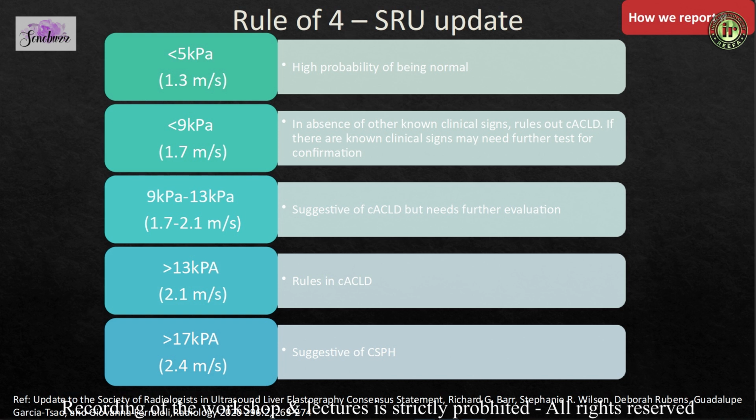Now this can be applied for almost anything, even in children, because there are no known cutoffs published for children. So even in these cases, when the kid comes to you the first time, you have those values as a baseline value, and you progressively go on monitoring these patients and say whether they have improved or whether they have worsened.